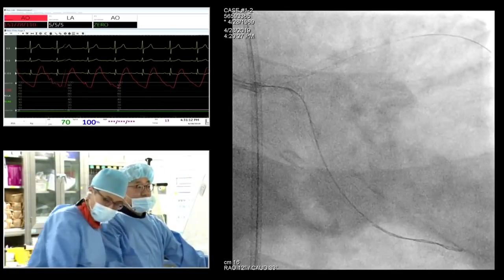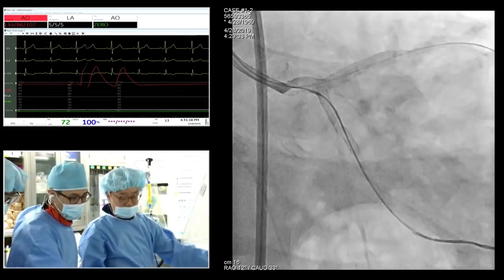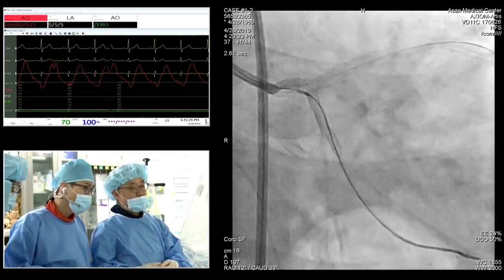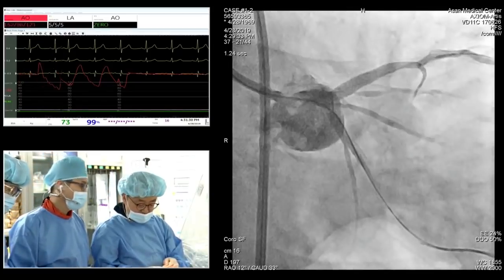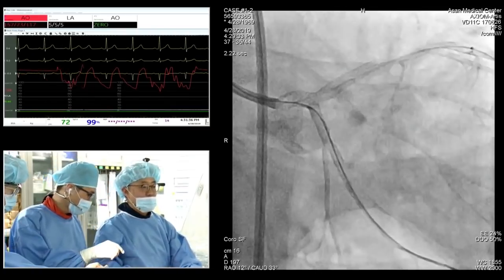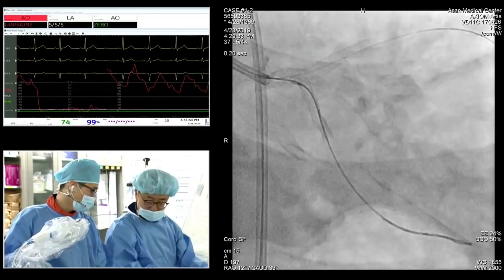Okay, angio ready? Professor Chen, actually, finally we do high pressure inflation, then kissing balloon. I believe we have a clear effective stent area, so you can compare with the DK crush. What's the difference? Over there, you still do kissing balloon first before the stent, and just like this after the stent and the high pressure inflation. So what's different? Yeah, this is a good idea.